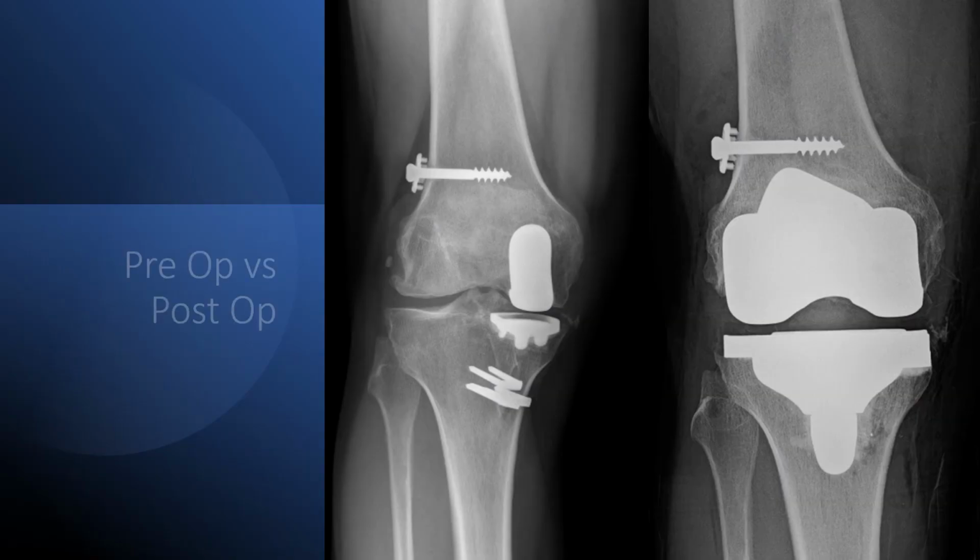So what does that look like at the end? So this is what we started with. We had a femoral screw, we had 2 staples, we had an ACL tunnel, we had a medial, femoral, and tibial component, and we had an associated bone defect. When we looked at the CT scan, we were able to know ahead of time that this was not in the way, so we wouldn't have to make a counter incision over here to take this out. That was out of the way.